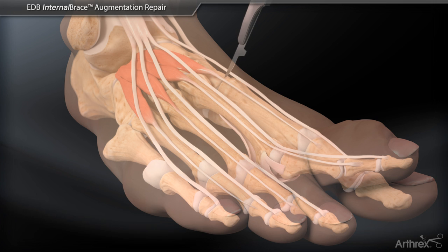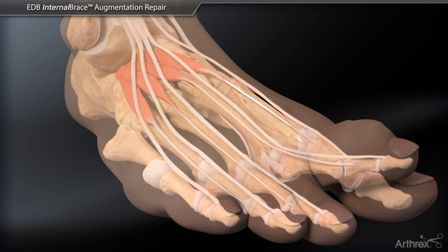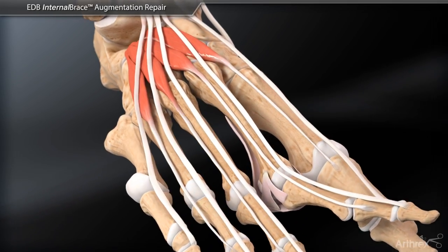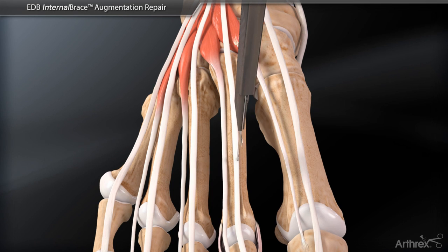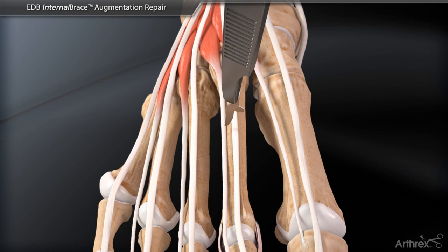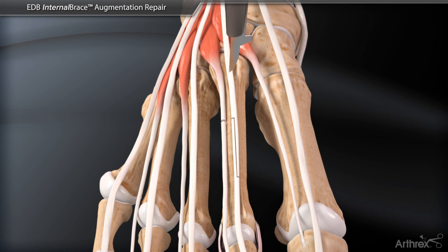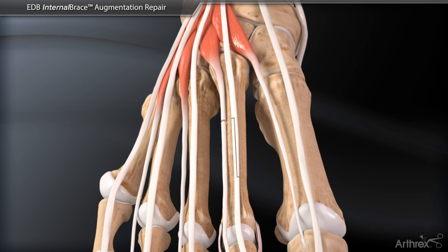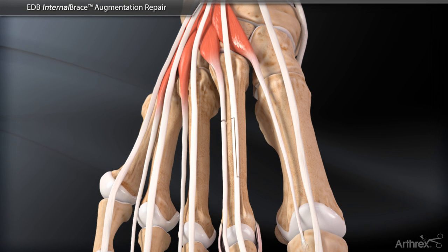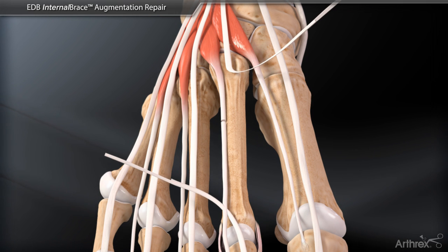Initially, an incision is made along the dorsal aspect of the second ray through the subcutaneous tissue to expose the extensor tendons. The extensor digitorum longus tendon is lengthened in a Z fashion. Next, the extensor digitorum brevis tendon is identified just lateral to the extensor digitorum longus and a tenotomy is performed proximally at the musculotendinous junction. The proximal and distal aspects of the extensor digitorum longus tendon are then tagged for later repair and retracted.